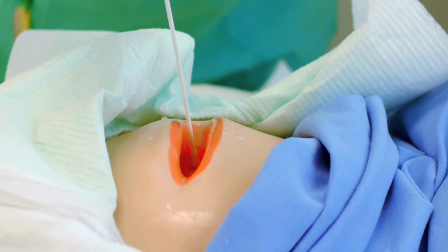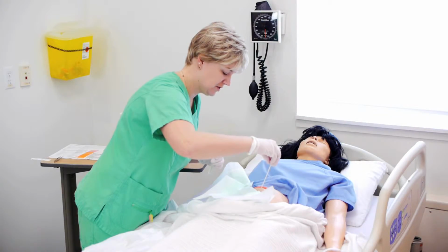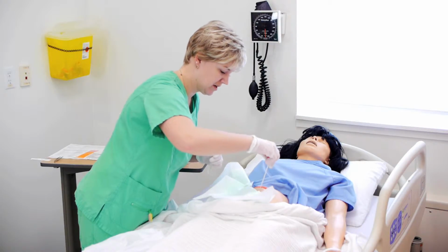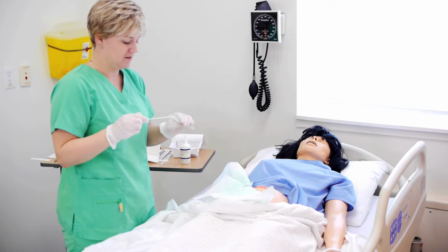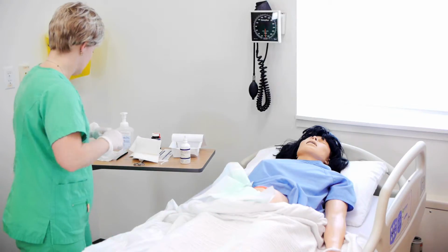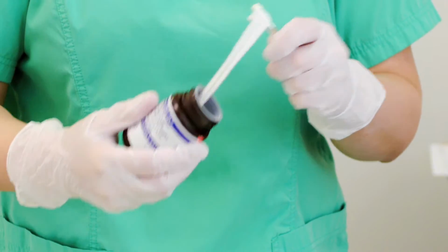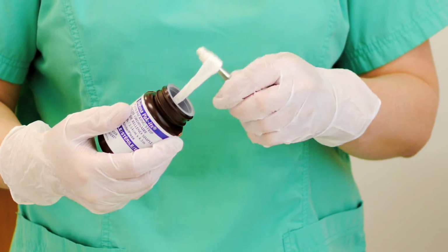The reason we don't swab any necrotic or non-viable tissue is because in all chronic wounds, that tissue does harbor some bacteria. It's the bacteria deep in your wound bed tissue that we're interested in culturing, as that bacteria is more likely than not to be the bacteria that is causing your deep tissue infection.